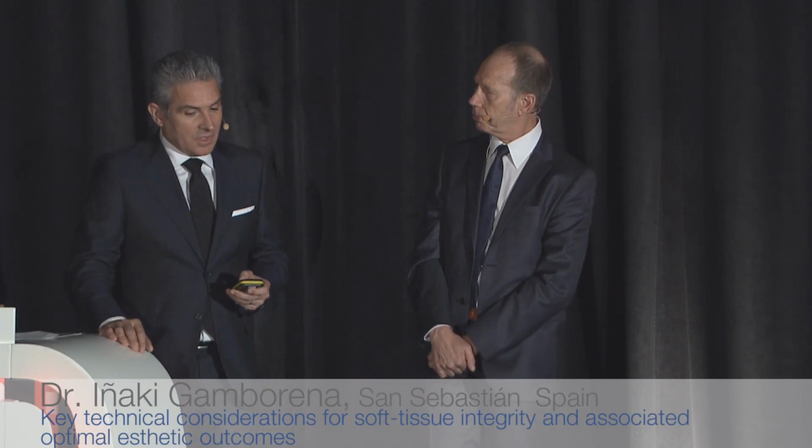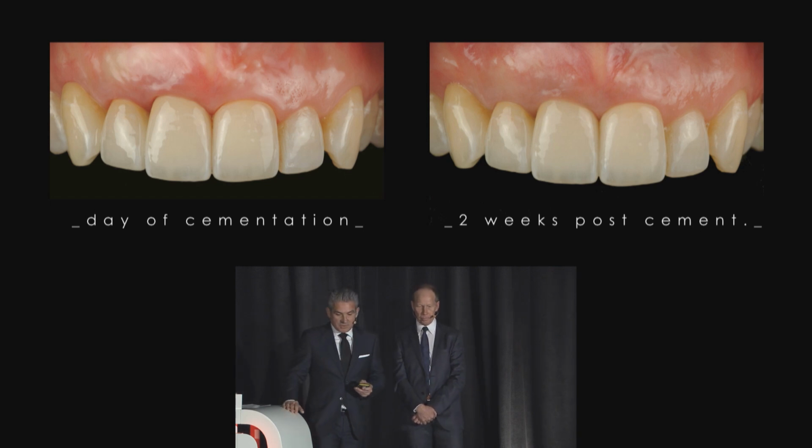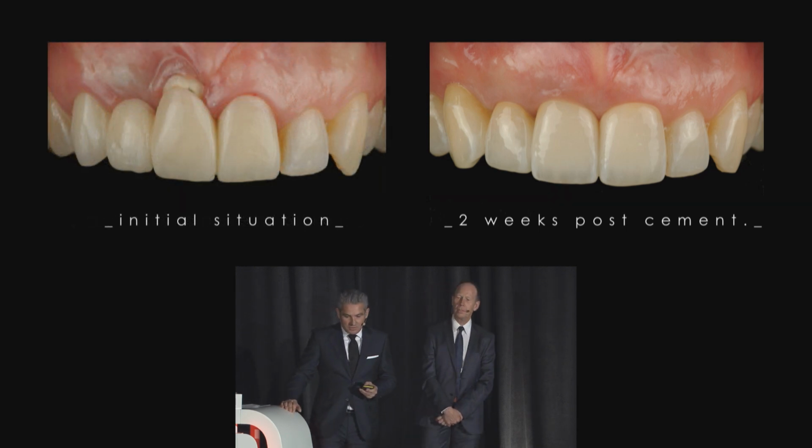This is the day of cementation. You can see the tissue is already brought up to a different distance. After 2 weeks, the tissue has come back. This case we finished already a year ago.